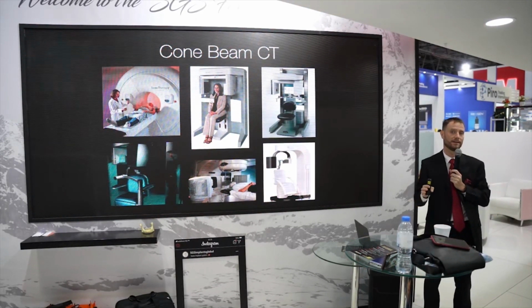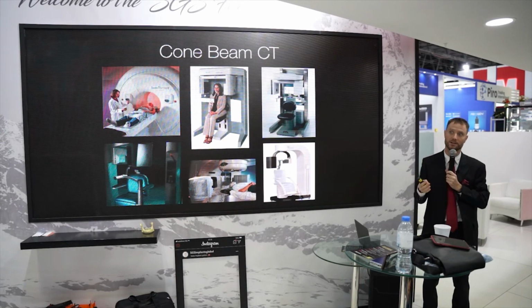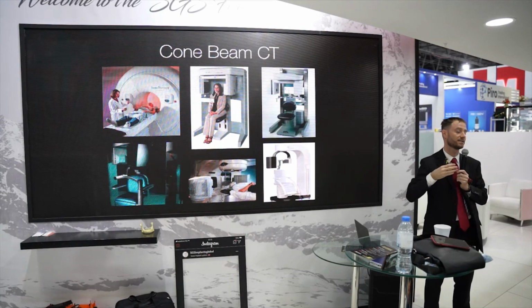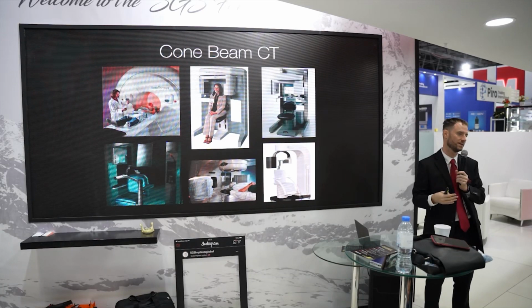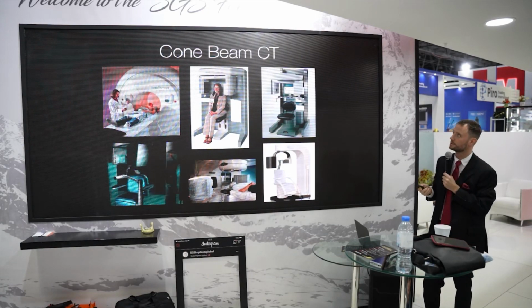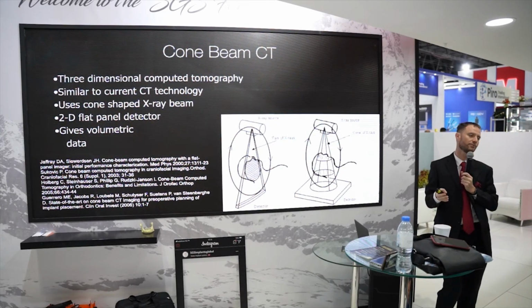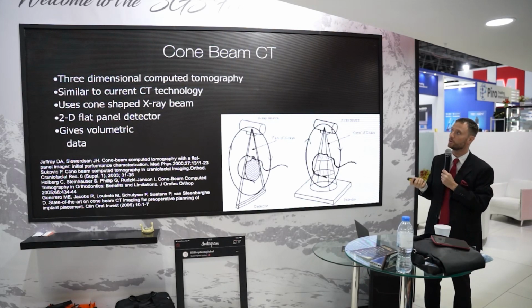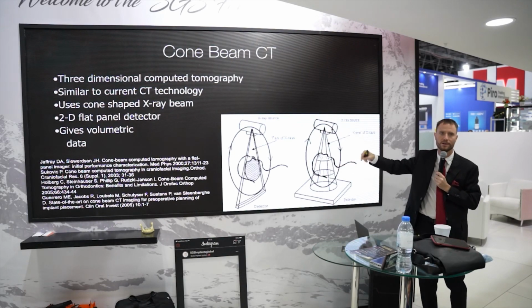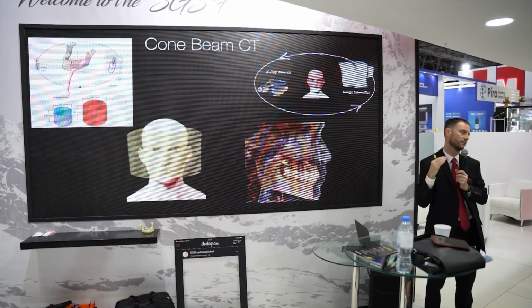What is today, I think, in most countries it's now described, and what I know in the EU countries, but also here in the UAE, it is a must. Before placing any implant, you need to have at least 1 cone beam CT in order to evaluate the bone. So cone beam CT is really the basic. It's somewhat different from the normal CT, and that's important for you to understand. We have a flat panel detector, and the whole X-ray is in a cone, coming from one source, and it will give us very nice volumetric data.